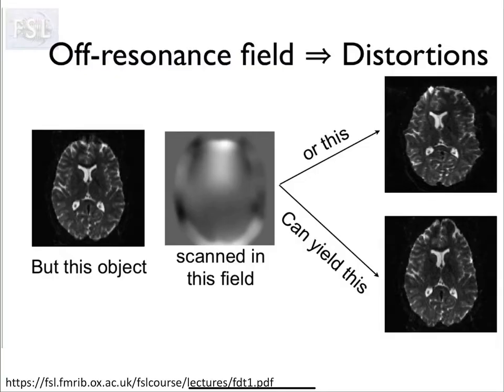And what that means is that because of the way the imaging is done, and we talked a little about k-space, you'll hear about things like AP versus PA, and it's like, what the heck is that? The idea is, in the Fourier domain, it depends on whether you go through k-space this way or this way. That's all it means.